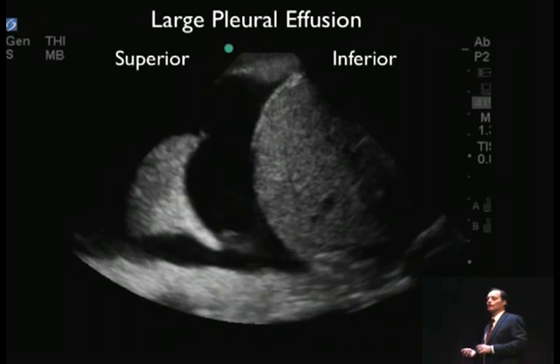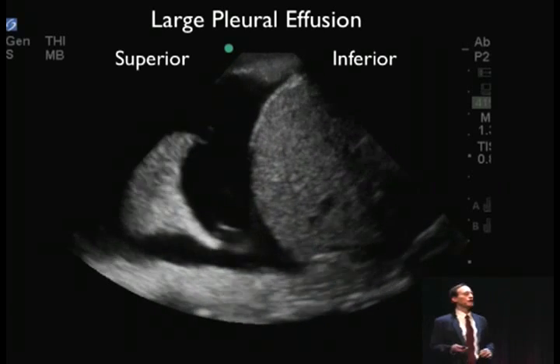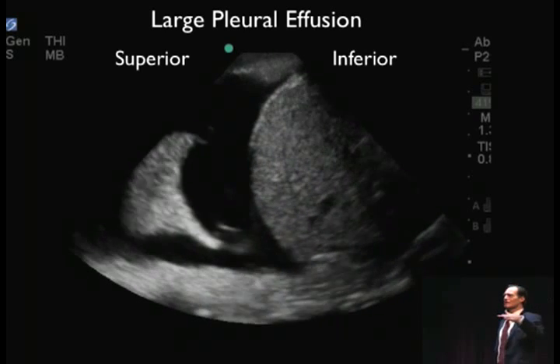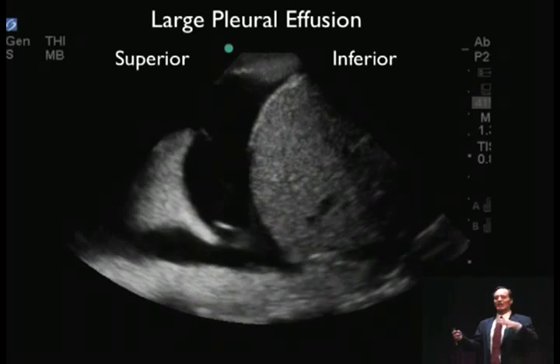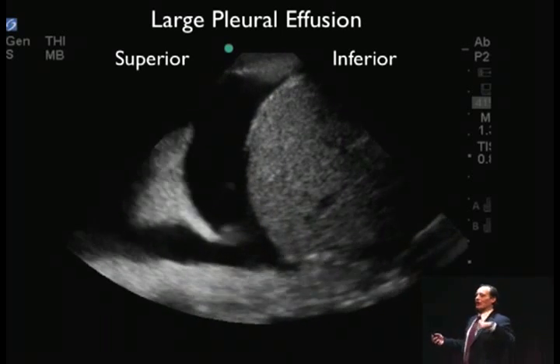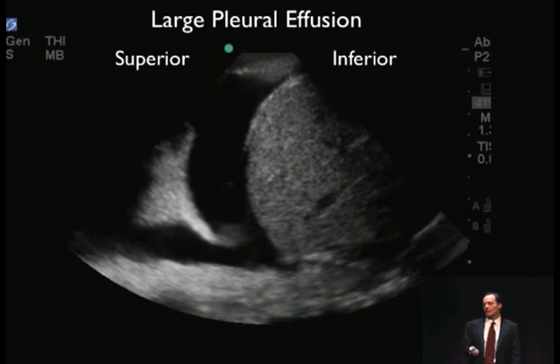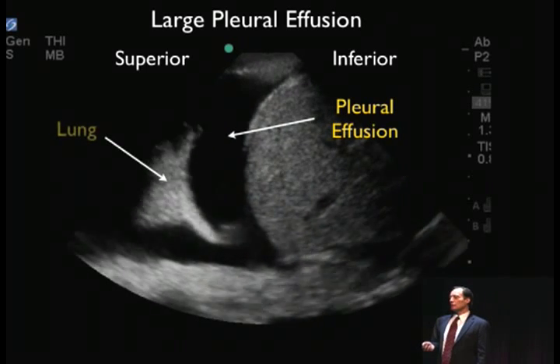So what's your next move? 40 over palp? How many want to go to the OR? How many want to do a chest tube? Chest tube? Couple hands up. OR? Kind of probably needs both, right? First of all, drain the chest and get the blood out, and you can actually auto-transfuse, and then you need to probably get this patient to the OR. That's a big injury there, but very positive examination. Okay, so that's the pleural effusion.